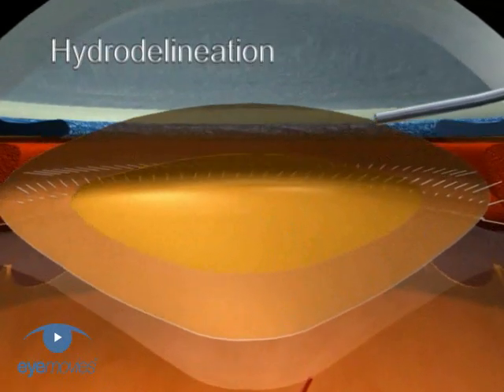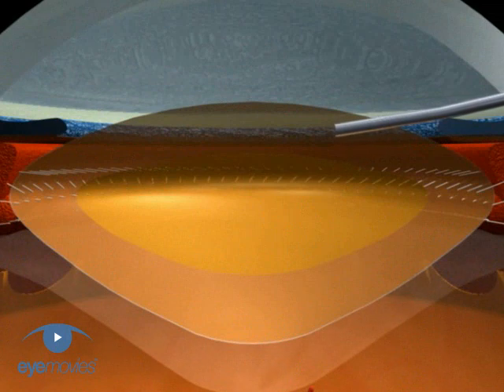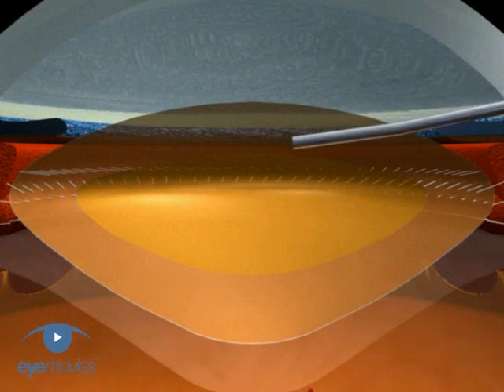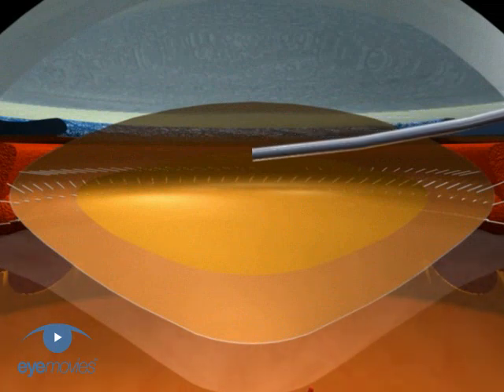To begin the hydro delineation, push the cannula into the central nucleus via the main incision. You should aim it as much posterior as peripheral.